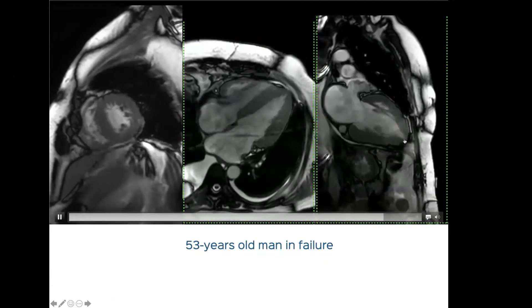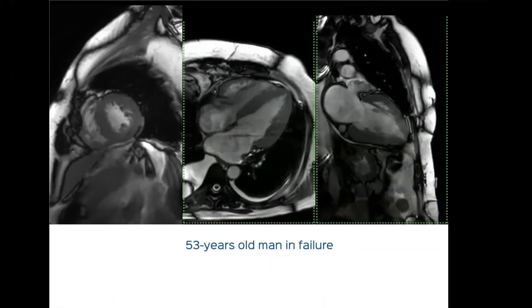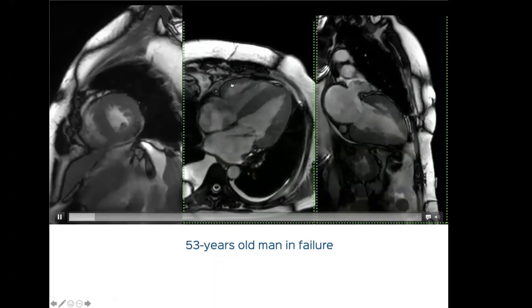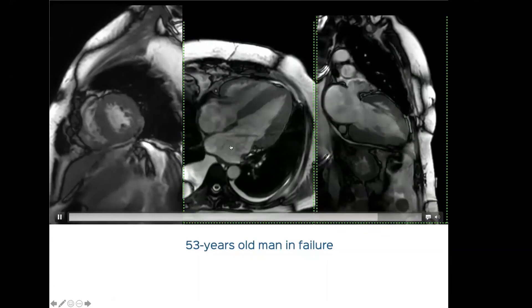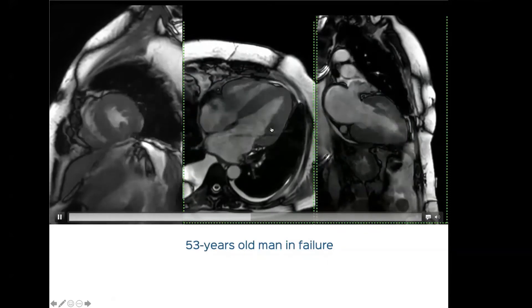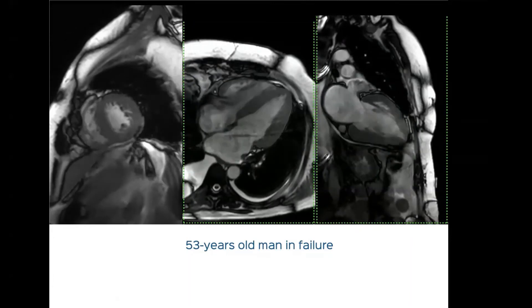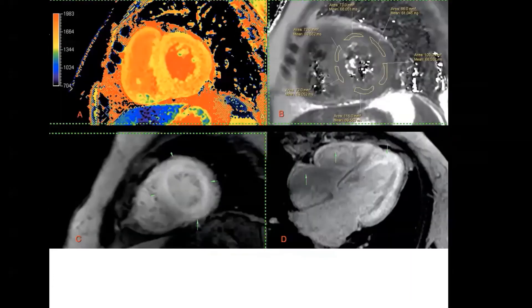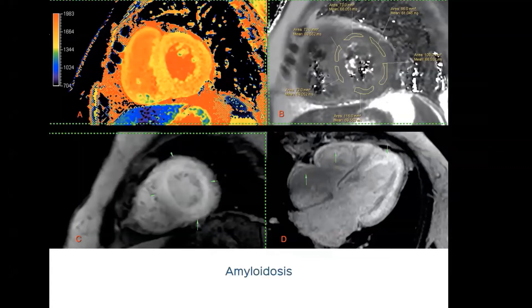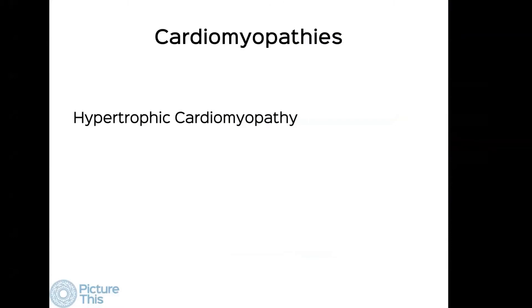Here is a 53-year-old man in failure with marked thickening of LV segments — when we see thickening it's either hypertrophy or infiltrative disease. The RV also shows thickening, there is biatrial enlargement, and mild MR. Amyloidosis is clearly on the cards. The T1 is sky high, and there is an abnormal pattern of diffuse enhancement in all four chambers — this is classic amyloidosis involving all chambers of the heart, a relatively easy diagnosis to make.